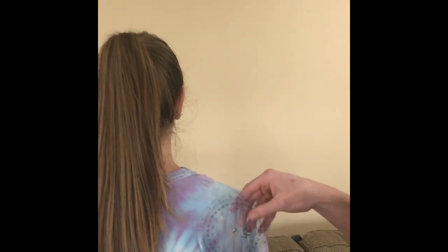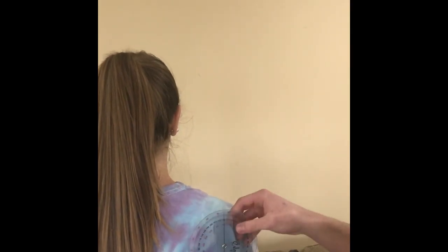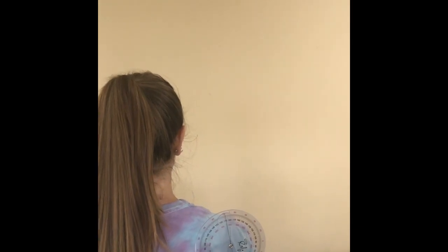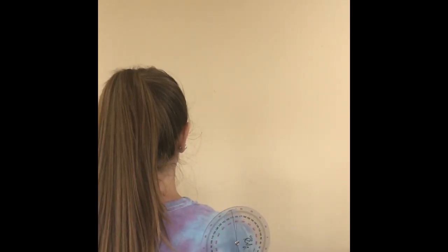All right, so now we're going to be measuring shoulder abduction. In order to do that, you're going to position your stationary arm at the perfect vertical, and then you're going to use the axis of rotation right here at the shoulder joint, and then your bony landmark is going to be the olecranon process and/or any part on the humerus that will stay stationary.